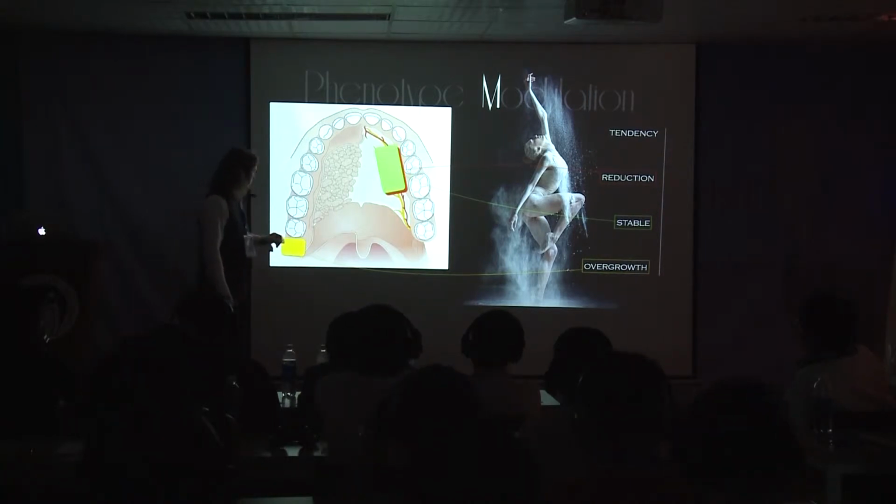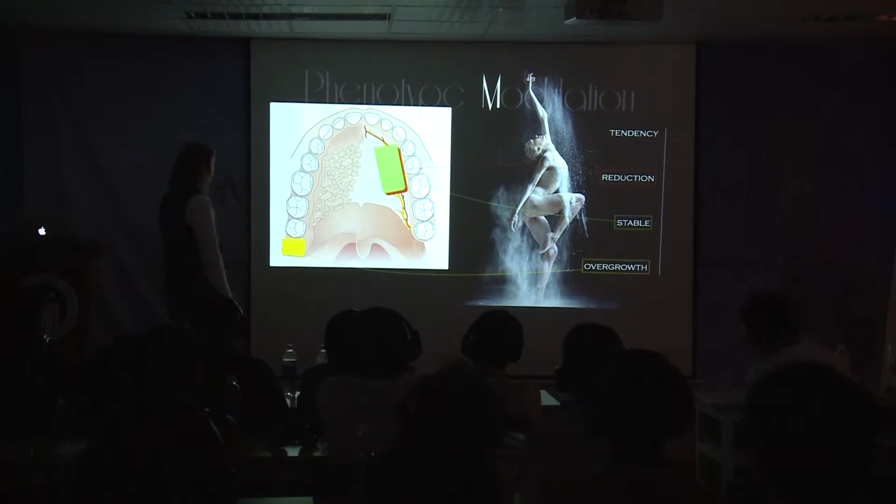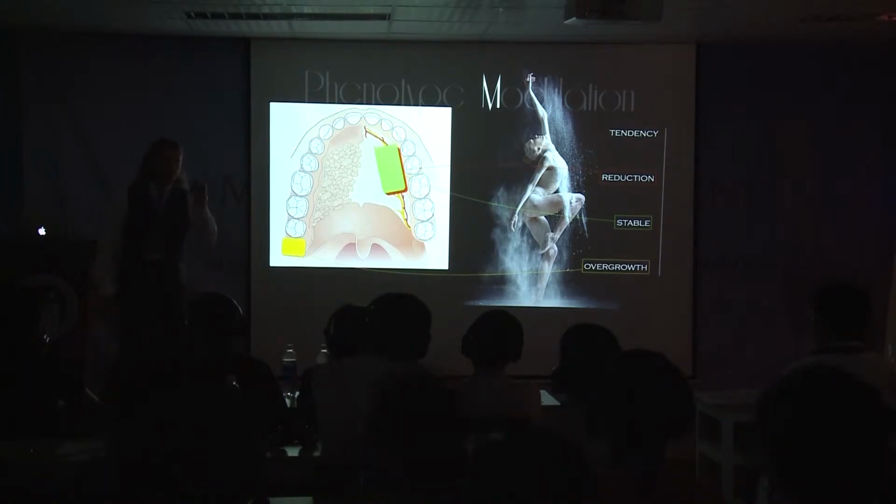Sometimes you might want to use the tuberosity. This is the most dangerous area. Easy to harvest. No pain for the patient, very little.